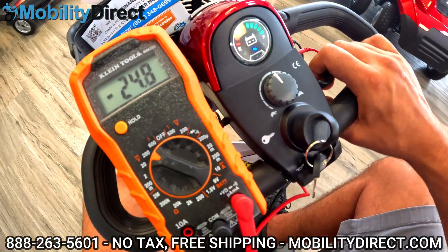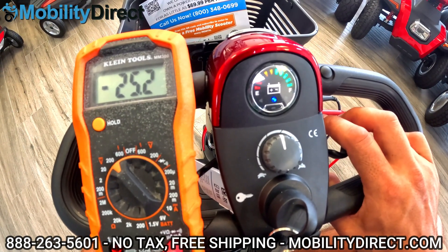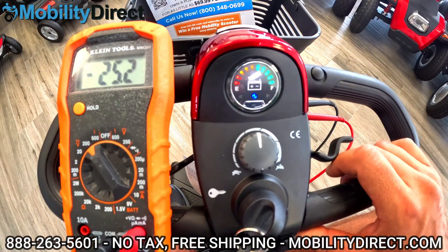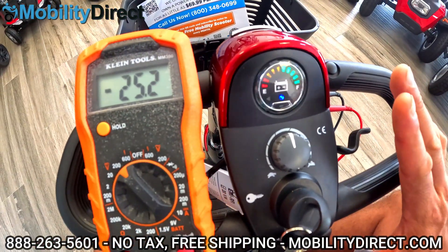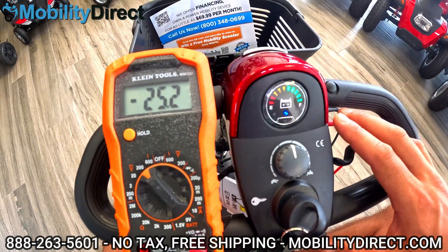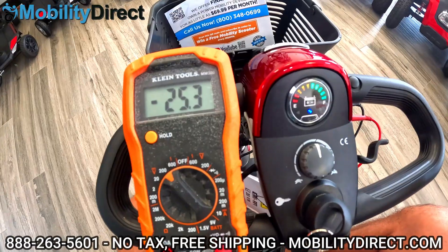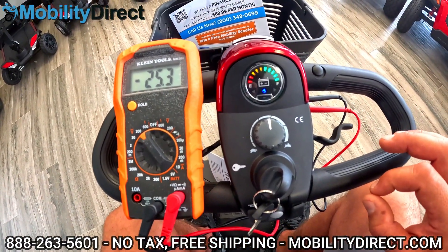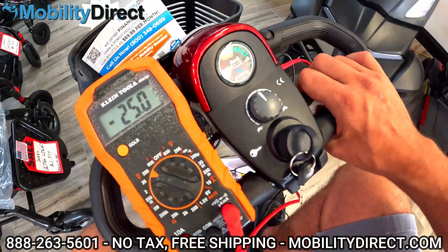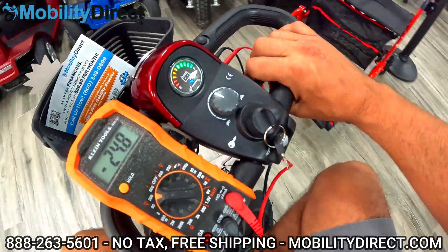I would say these are pretty close to being new batteries. At a standstill we have 25.1, so it did lose a little bit of charge and it seems like it's crawling back up. My guess is these batteries are about three to six months old. If they were brand new, you'd see that voltage at standstill barely changes after doing a load test. It's really important that you charge your batteries regularly to get the longest life out of them. Never leave your batteries storing without being charged for more than a few weeks — that can damage the lifespan of your batteries very quickly.